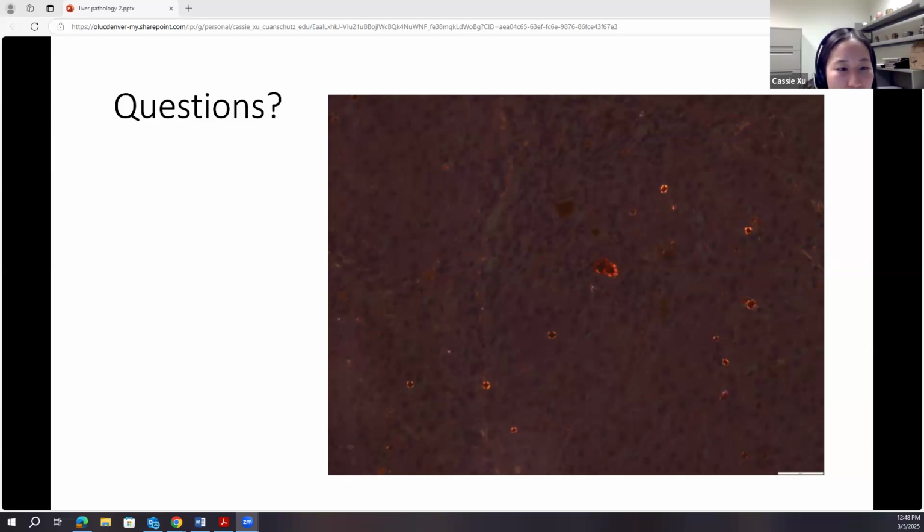And then one other thing to note about autoimmune hepatitis. Sometimes, for me at least, I'll give the pattern of injury. The pattern of injury might be interface and lobular hepatitis, and then I'll say see comment. And then I'll usually include a differential: drug-induced liver injury, viral hepatitis, and autoimmune hepatitis. If it doesn't look plasma cell rich, I still keep it on the differential.